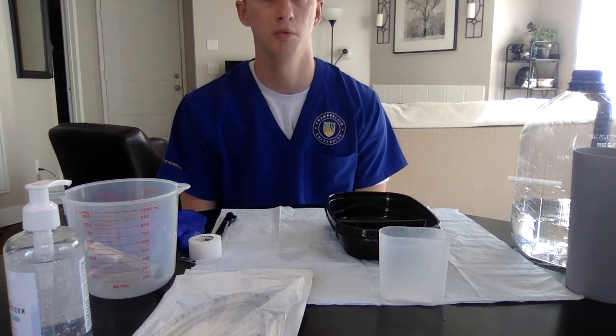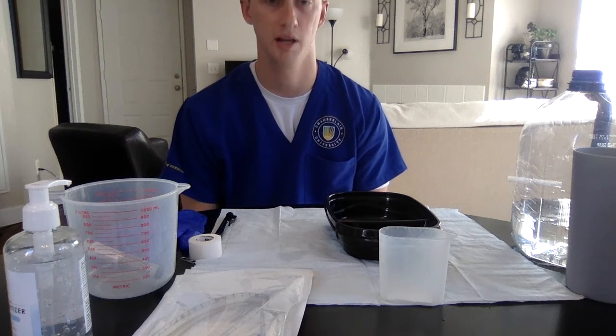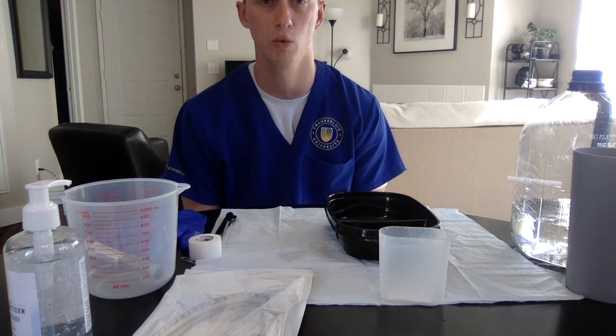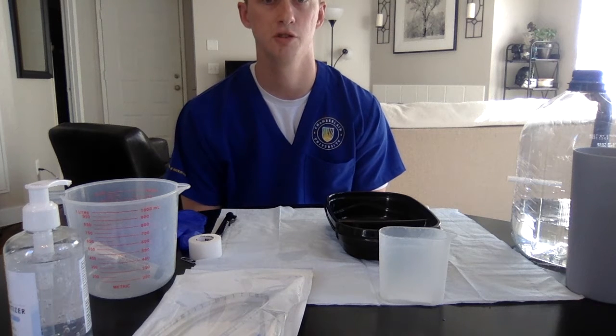So upon entering the room, I would identify myself, and I'd say, my name's Ryan, I'll be your nurse for today. I would then identify my patient with their 2 patient identifiers, so ask for their name and date of birth. I would assess if they were in any pain today, or if they had any allergies that we need to be aware of. I would then move on to explain the procedure to the patient.